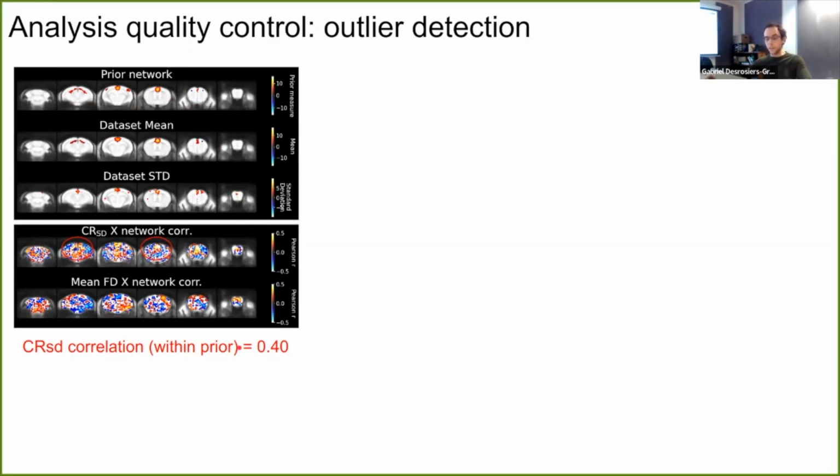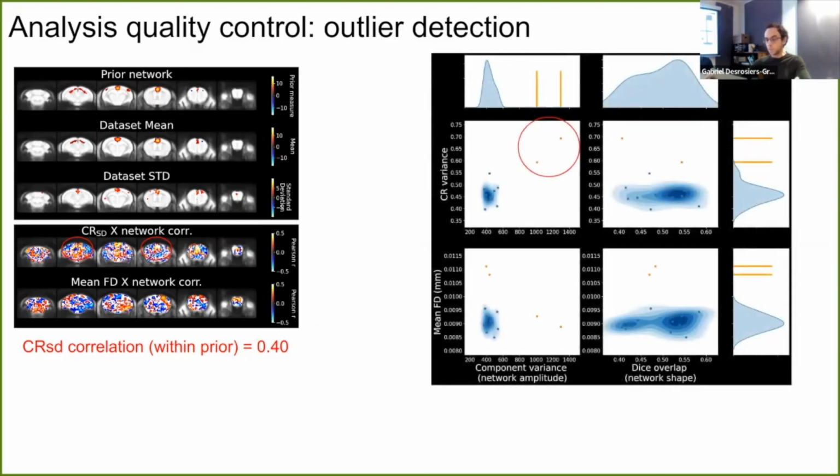And to understand what was happening, there's a final output that I want you to consider, which is distribution plots, which are useful to detect some outliers or to visualize the correlation structure across your different scans. So these plots are essentially another version of these maps here, but instead of being spatially defined, they're distribution plots to see the distribution of scans.